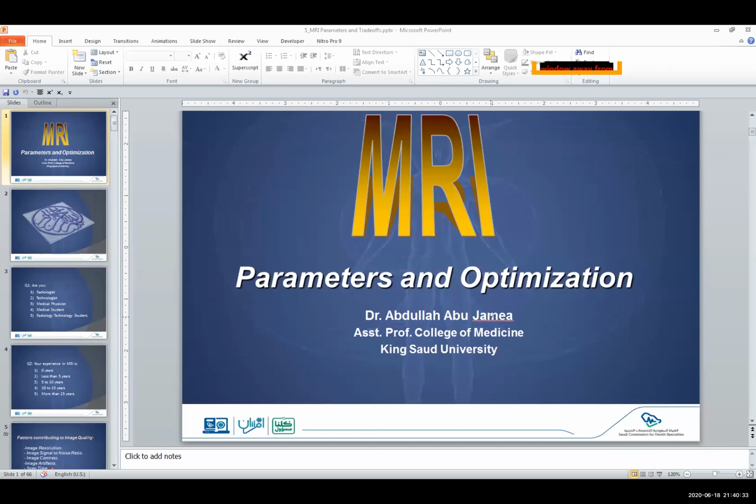What kind of contrast agent is used in MRI to enhance the images? What we mentioned in this lecture is natural contrast, meaning the contrast that is based on T1, T2, and proton density. Sometimes those are not sufficient, so we inject the patient with contrast. There are two types of contrast in MRI. One works on T1 and one works on T2.